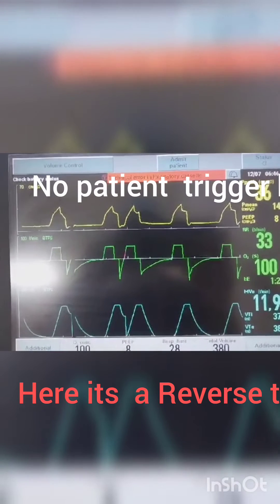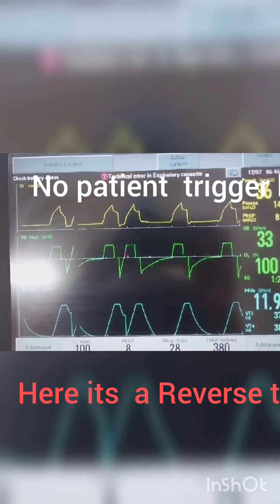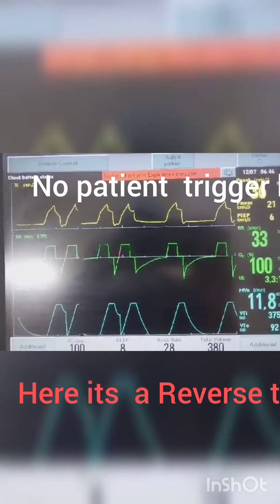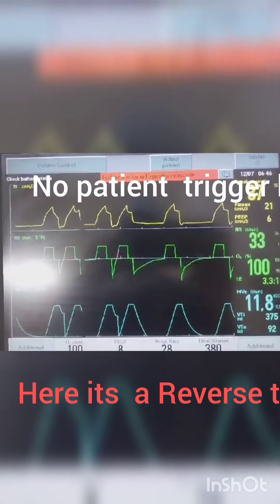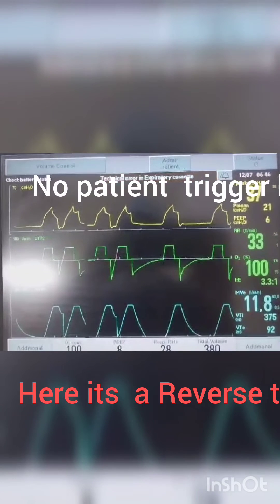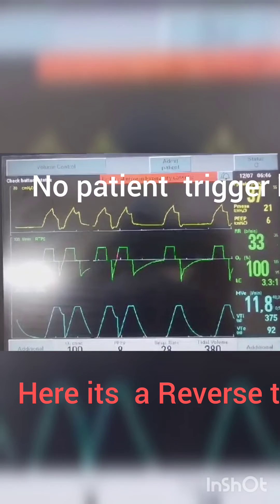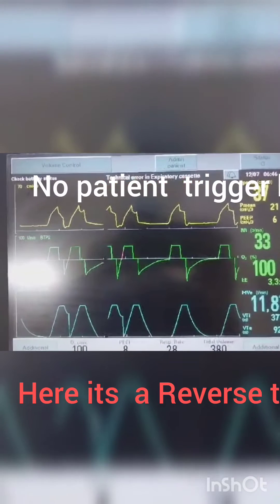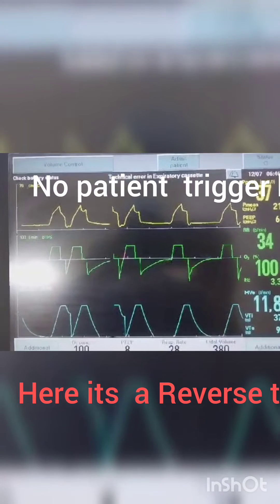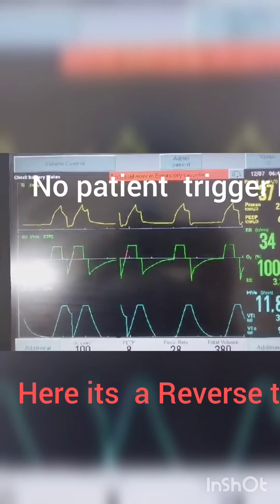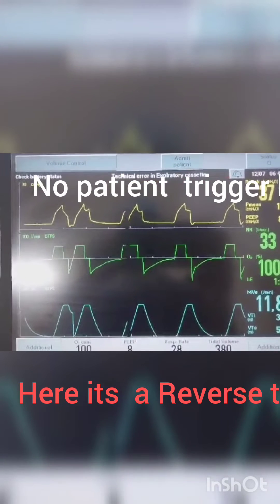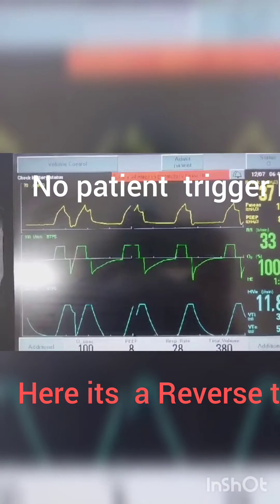How to differentiate between double trigger and reverse trigger? If there is a passive breath — meaning there is no patient-triggered breath — it is called reverse trigger. And if it is a patient-triggered breath, then it is double trigger.